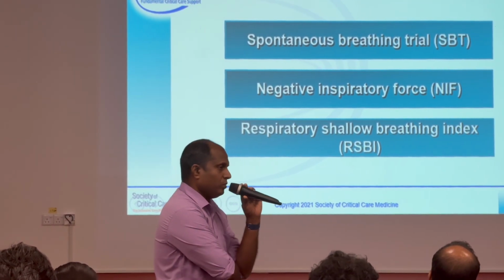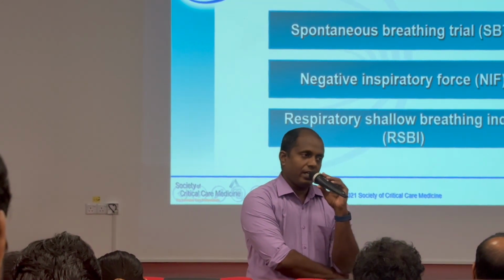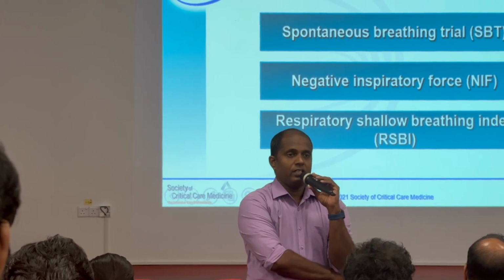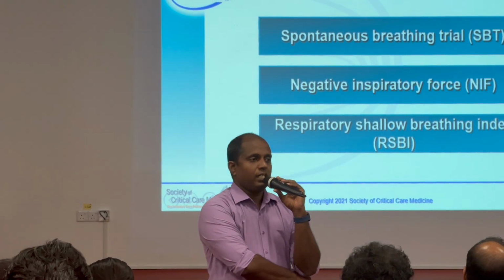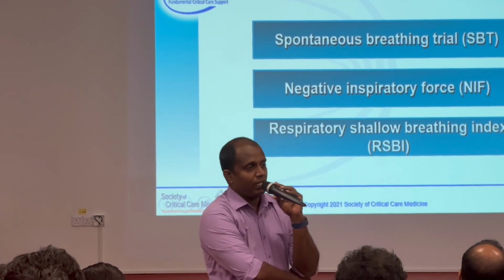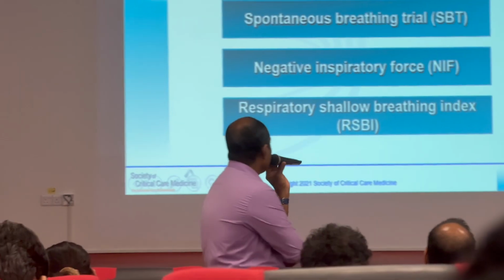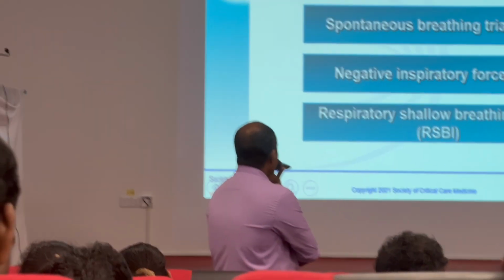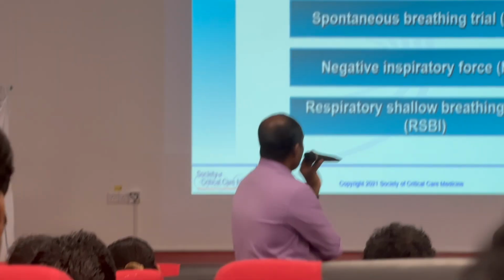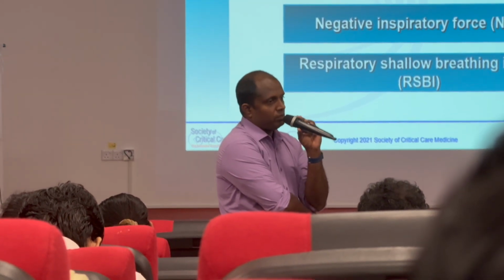What are the things we need to monitor? Work of breathing, respiratory rate, how the saturation is going, and do the blood gas and see how things go. If he has passed the test, that means what? He's ready to come off. So the spontaneous breathing trial is a valid tool. It's called a test drive. It can be used before extubation.